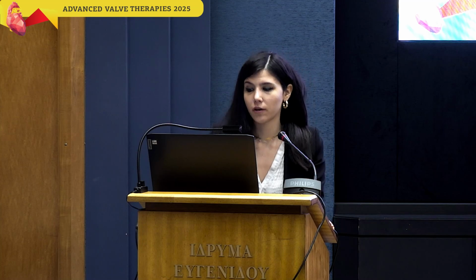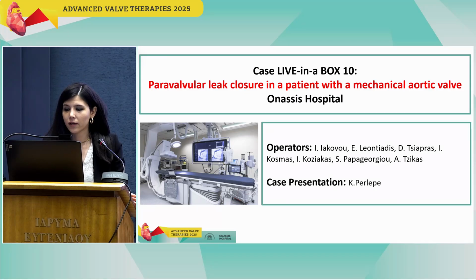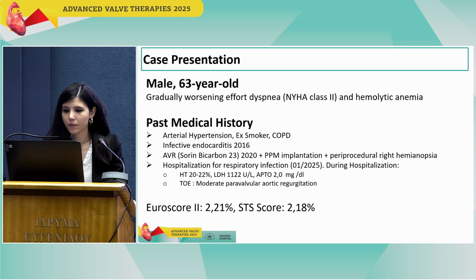I'm going to present you another interesting live-in-a-box case, this time involving the transcatheter closure of a paravalvular leak in a patient with an aortic mechanical valve.